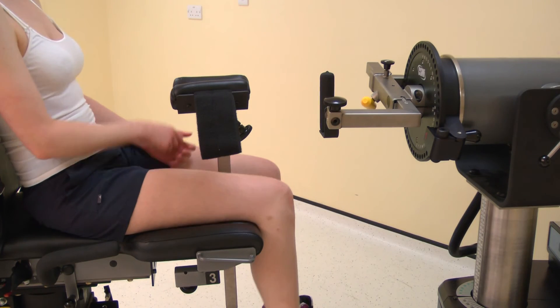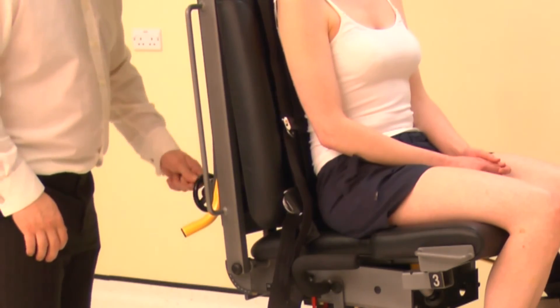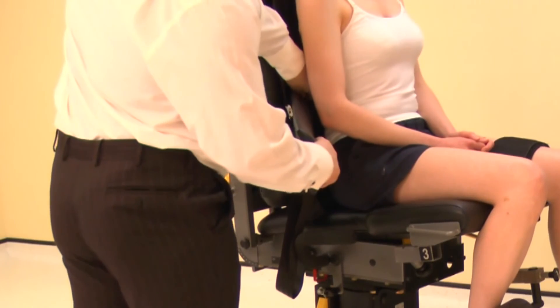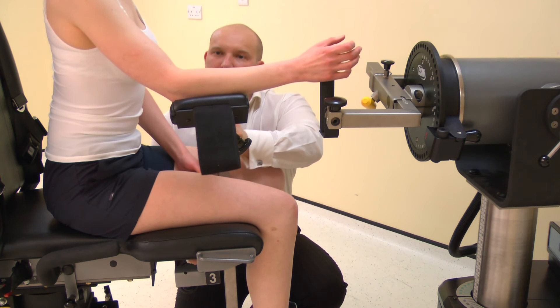Once the norm is positioned, ask the subject to sit on the chair and rest their forearm on the stabilizer. The chair back translation may be adjusted at this stage to support the trunk. Use of the lumbar cushion may be necessary for comfort. Then adjust the height of the stabilizer to attain the correct elbow angle.